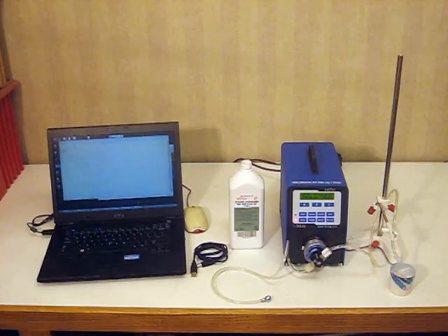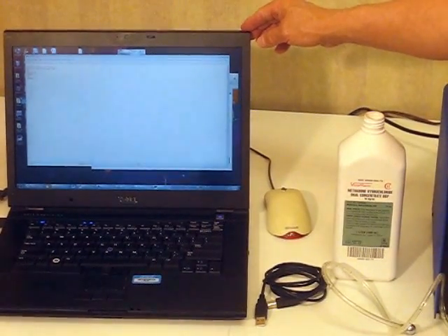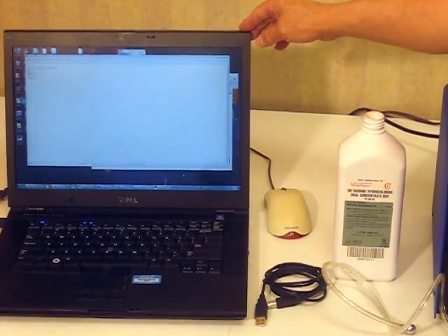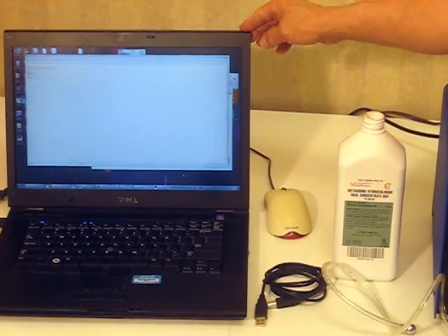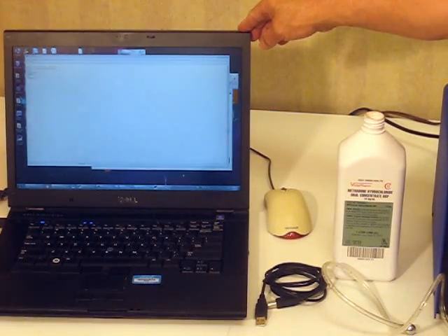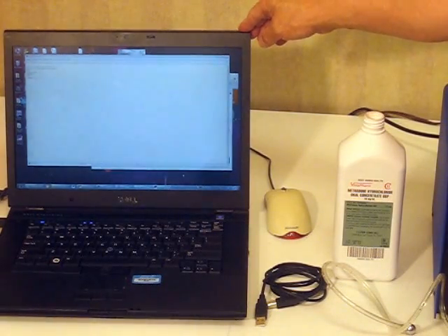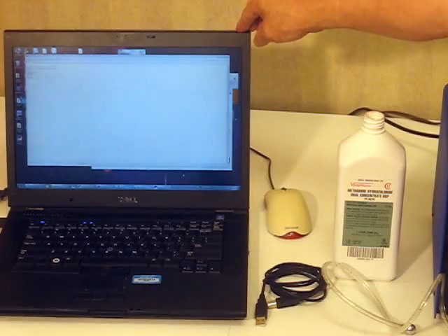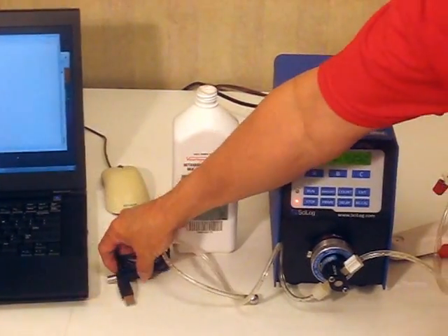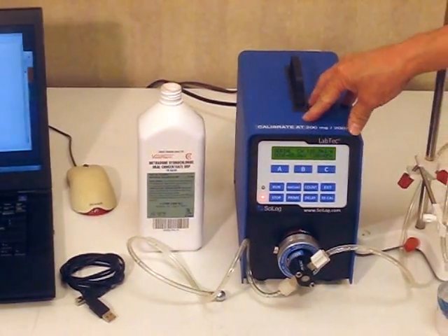Let me take a moment to point out the major components of the system. First we have a PC. This PC is loaded with your specific patient software program. This is your program that has the commands in it that tells our system, our Methadone pump, how many milligrams that patient should be receiving. Once you output that command, it goes by way of a USB cable to our Labtech Methadone pump.